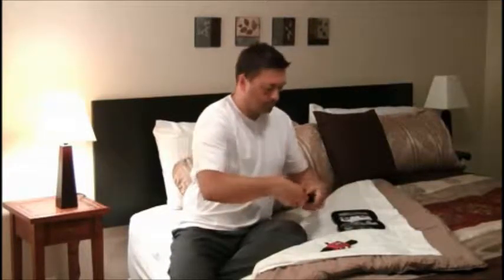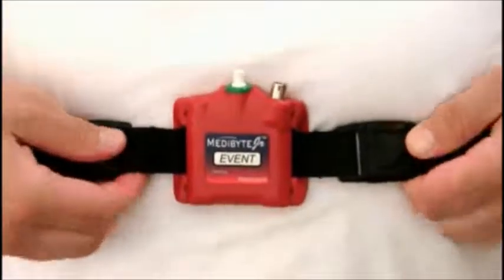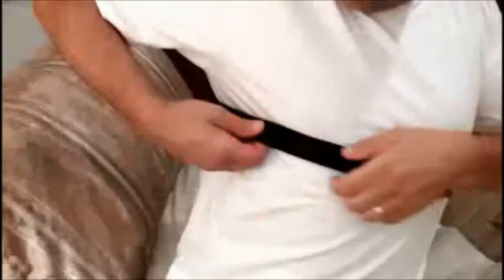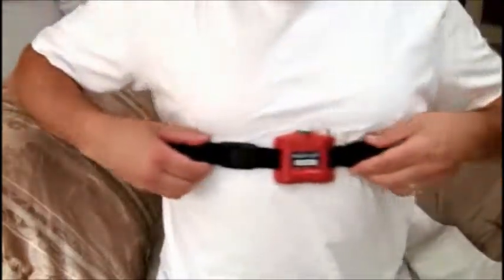Connect one side of the effort belt to the unit. Next, wrap the belt around your back and connect it to the other side of the unit, keeping it chest-high, with the unit centered on your chest, right below your breast. If the effort belt is loose, simply adjust the strap so that it fits snugly enough that it will remain in place while you're sleeping.